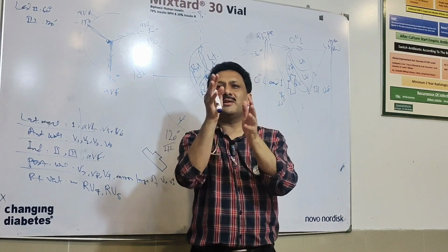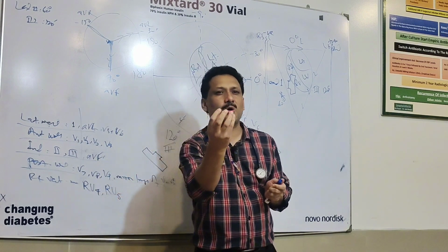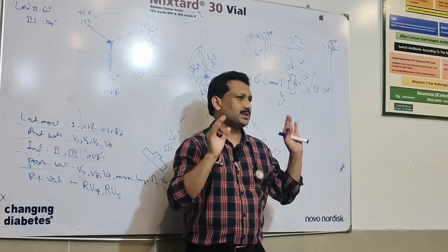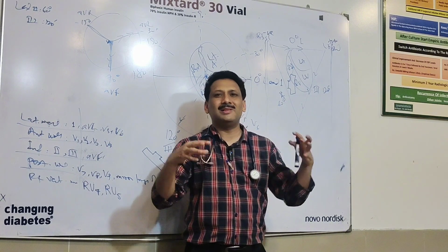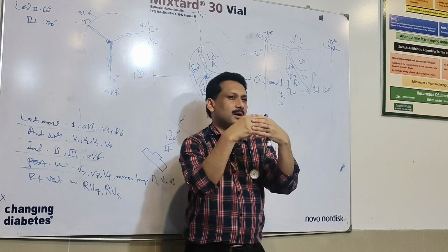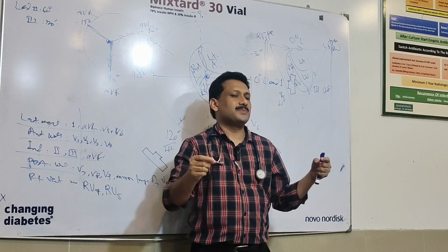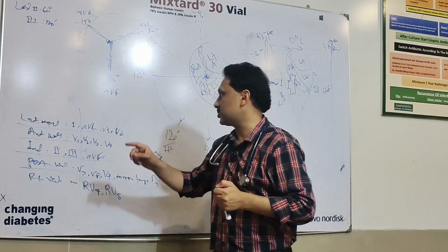So you see that their dimensions and directions are different. So how will we draw these 12 ECG leads in a normal person? This is what you are going to understand in the next 5 minutes, and that will basically be the end of the major basic ECG session. Onwards, I will have a little bit of questioning, answering, and kind of a workshop.